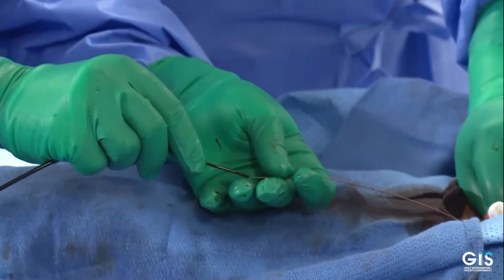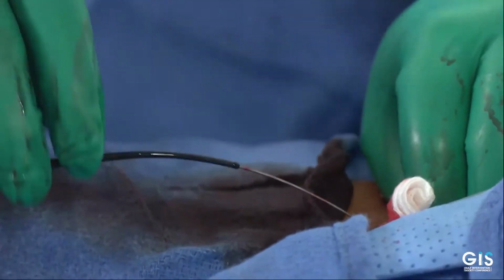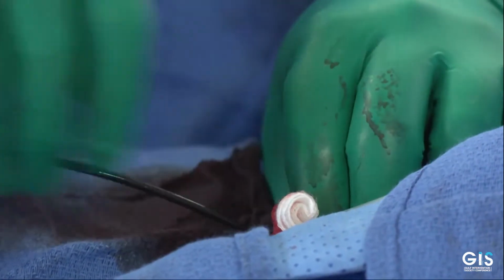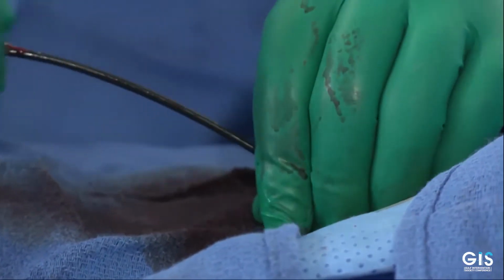In our practice here, we use a single ProGlide and we close with it. And if we need a second ProGlide, we add it at the end of the case.